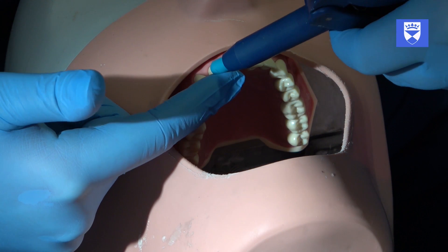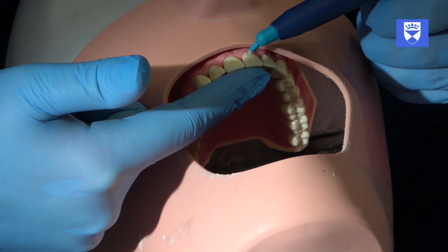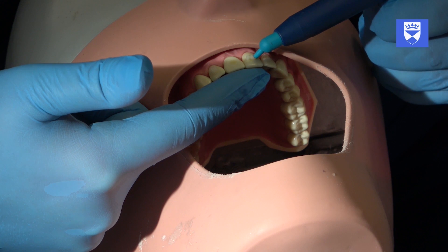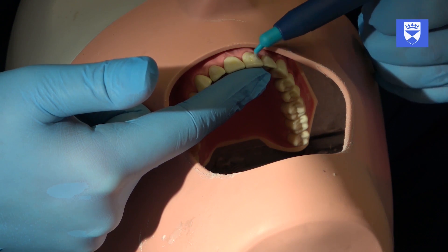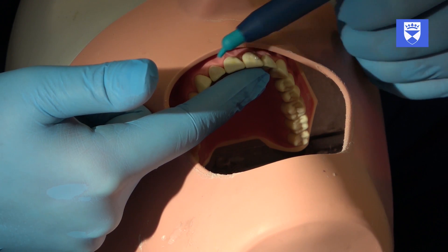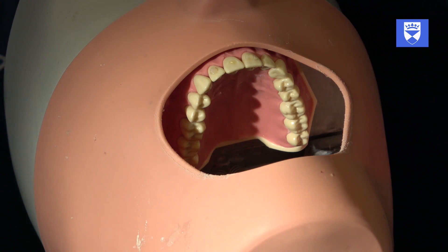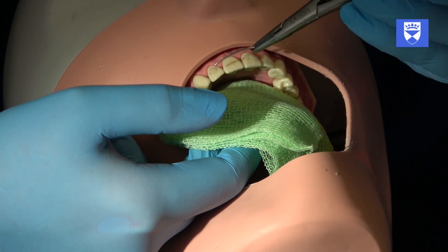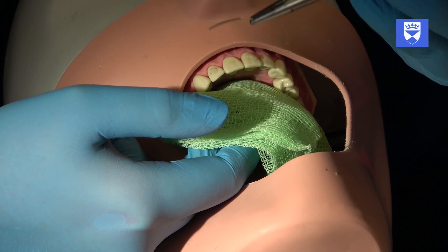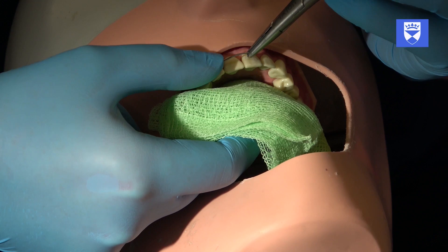Secure the splint correctly incisor-gingivally by placing small amounts of composite onto the labial surface of the abutment teeth. Start with the mesial and distal ends by affixing the splint first to the abutment teeth. This will allow us to securely reposition and confirm accurate positioning of the traumatized tooth before finally fixing it to the splint. With gentle pressure, push the wire into the composite and adjust the composite as necessary with a flat plastic or other shaping instrument.